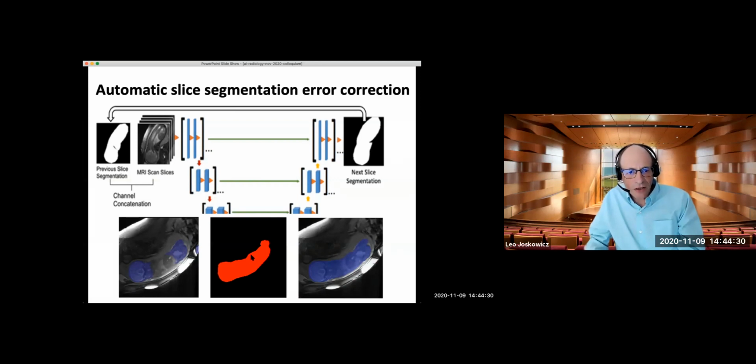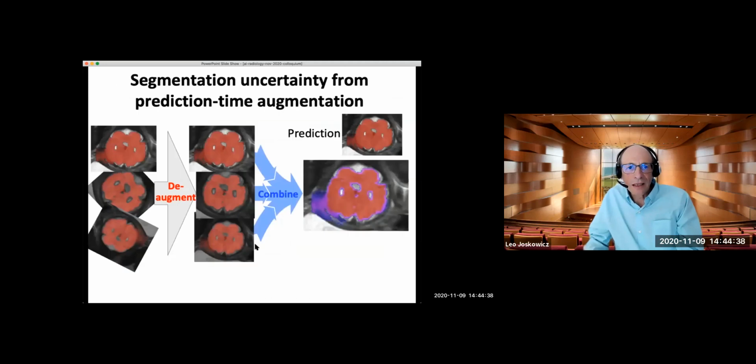This is the segmentation. We see here that a whole part of the body was missing, and this is how the network managed to do this correctly. Okay. How do we do that? Well, we do the following. If you don't just take the average like I did before, but combine all these to compute the uncertainty.